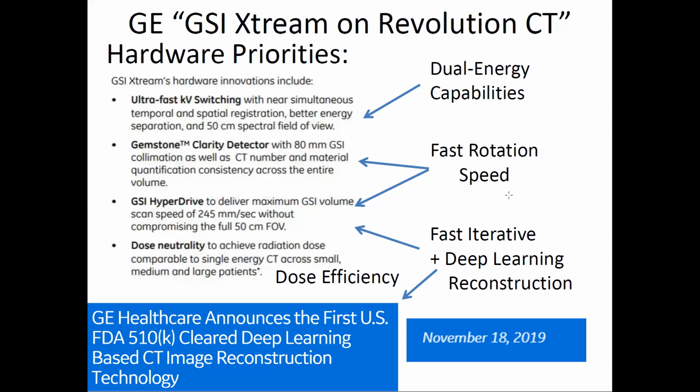So one of the big goals for reconstruction is to support lower dose, and your measure of the performance of your system for CT has to be done in terms of minimum dose. You want to have maximal performance defined for your clinical task at hand with minimal dose. So the other big development within less than a calendar year was the first deep learning CT image reconstruction.